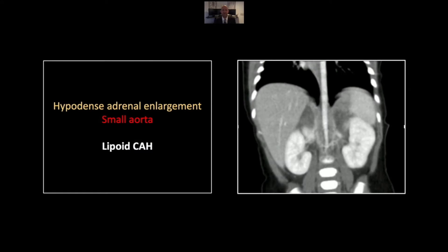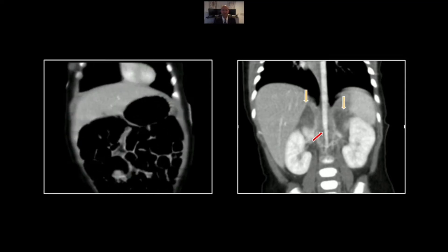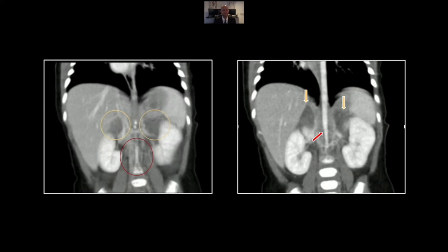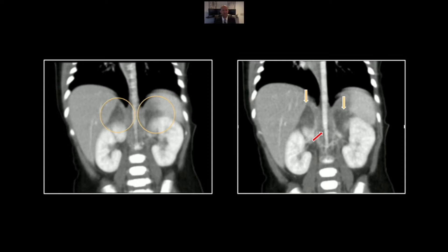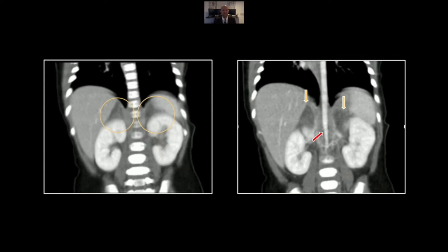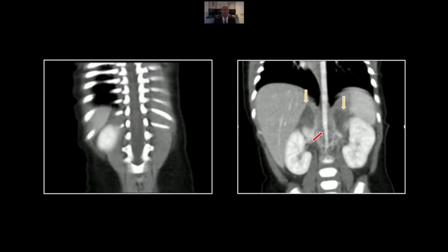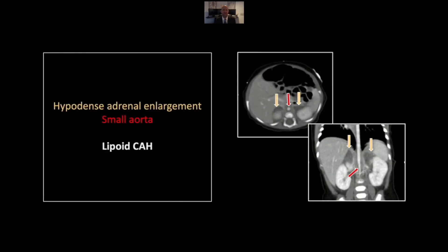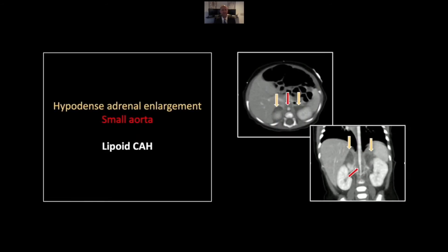You can see this even better on the coronals where you see those enlarged and fatty infiltrated adrenal glands. Again, that markedly tapered aorta, which is diminutive even for this small patient. There are the adrenals and that small abdominal vasculature. That is a case of lipoid congenital adrenal hyperplasia.